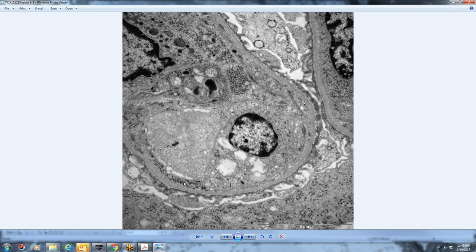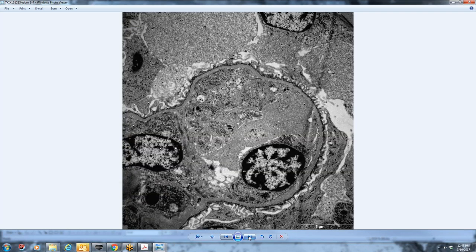This is the reminiscent rest of the lumen, and this is all cytoplasm for this particular cell. We kind of lost the endothelial fenestrae. So if this were within five minutes, then we would think it very well may be a true lesion, but we always worry that this is one of the first things to go during autolysis is the endothelial cell kind of loses its fenestra and they kind of solidify.